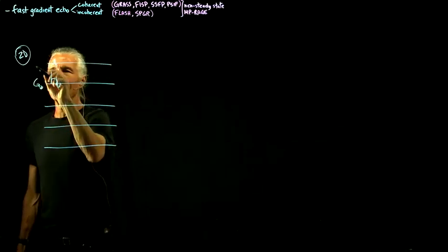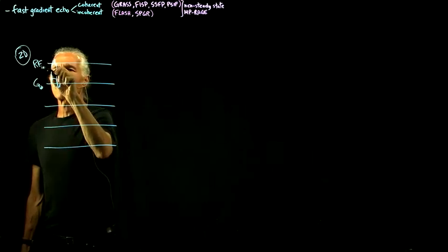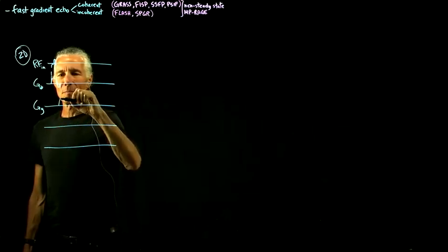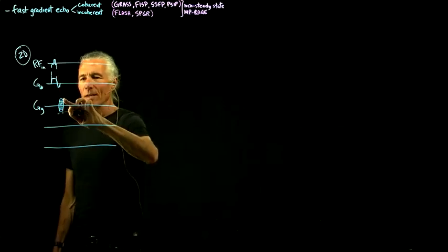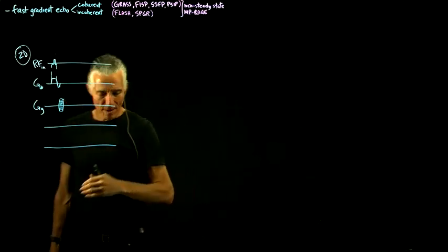So that's GZ, here's RF in, what we're sticking into the brain. Here's the phase encode direction. We pick one of these settings of the phase encode gradient to wrap up horizontal stripes in the Y direction.